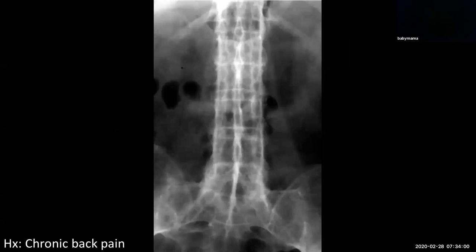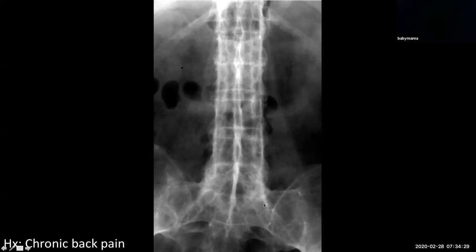How about this case? Patient with chronic back pain. We see flowing bone formation between not only the pedicles — likened to the train track sign when pedicles are fused — but also the spinous processes, called the dagger sign. Another tip-off for this diagnosis: we can see the superior aspects of the sacroiliac joints are fused. This is a case of ankylosing spondylitis, and the next thing you want to confirm is that this person is HLA-B27 positive, or have other laboratory markers to indicate this underlying disease.